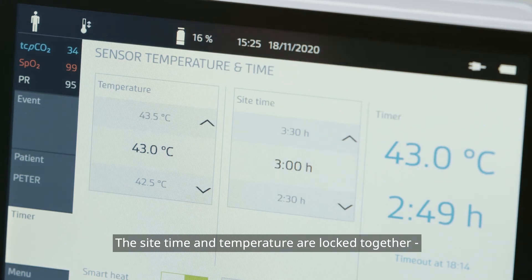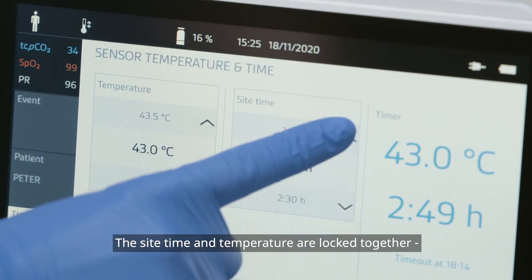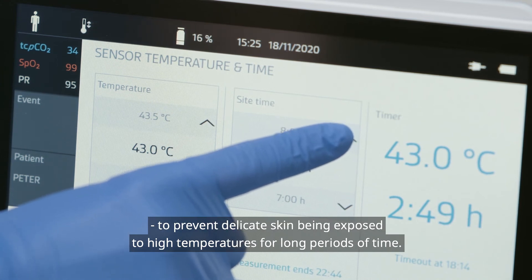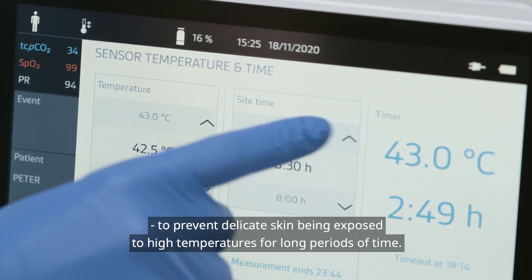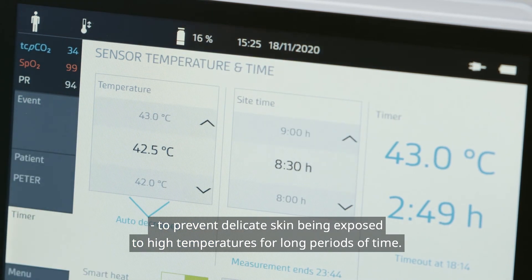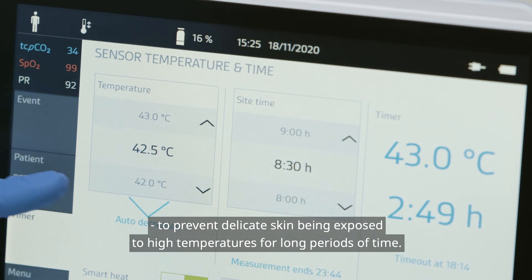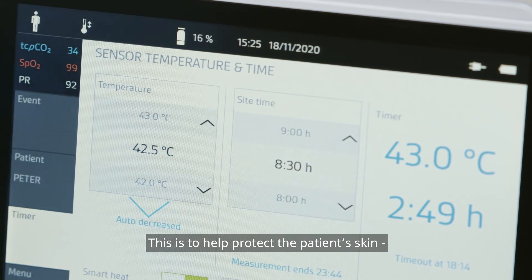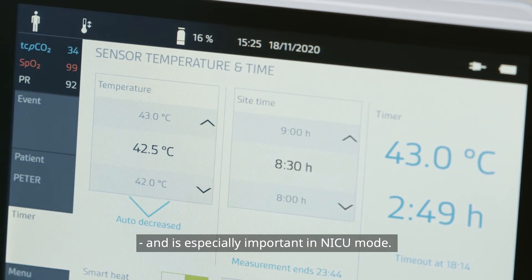The site time and temperature are locked together to prevent delicate skin from being exposed to high temperatures for long periods of time. This is to help protect the patient's skin and is especially important in NICU mode.